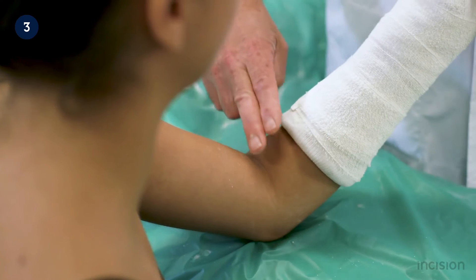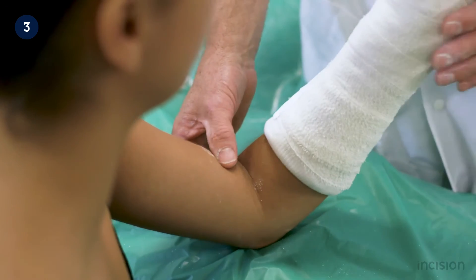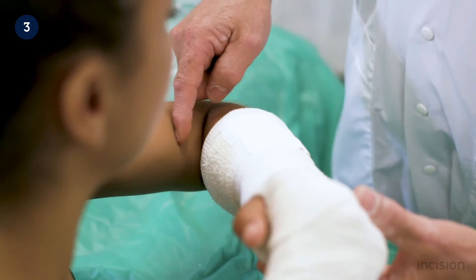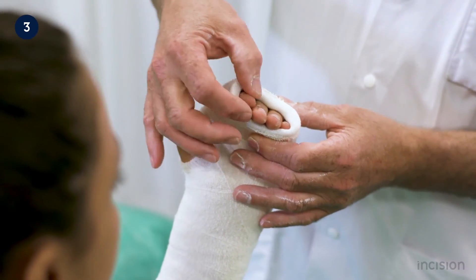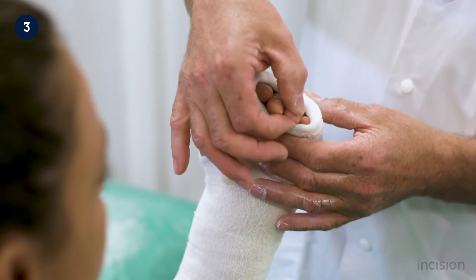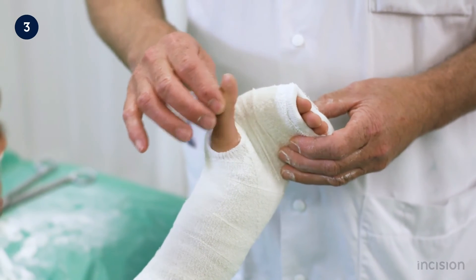Following application of the splint, it is important to check that there is at least two finger breadths distance between the plaster and the elbow joint to allow bending when placed in a triangular bandage. The fingertips are examined to ensure alignment, capillary refill is reassessed and compared to initial findings, and the thumb is examined to ensure it can freely rotate within the splint.